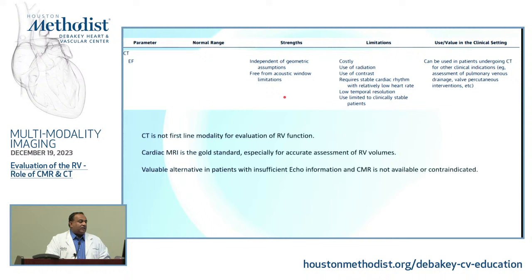The limitations, of course, are that it's costly, there's radiation involved, there is contrast involved, and actually, if you want to look at the RV as well, you need to give contrast for a longer period of time. It is dependent on having a stable cardiac rhythm. And the temporal resolution of CT, of course, is way lower than echo, and that's just the limitation of the technology.